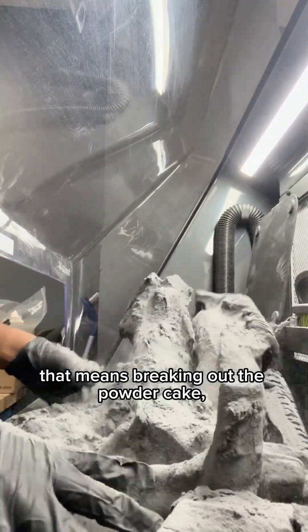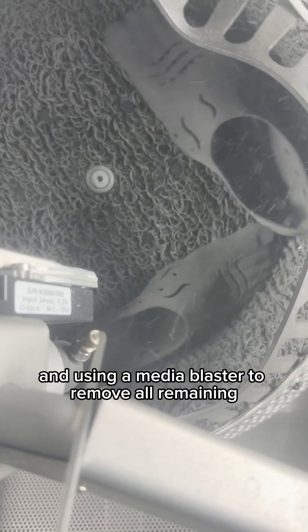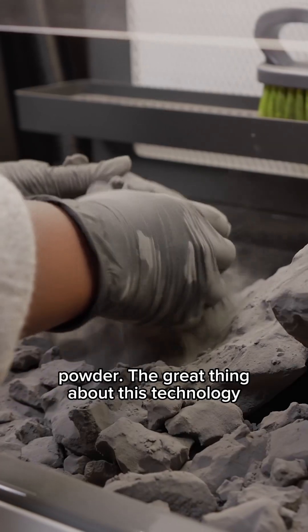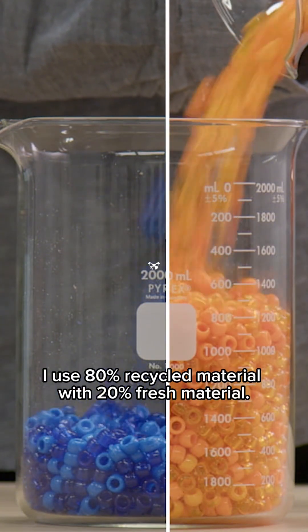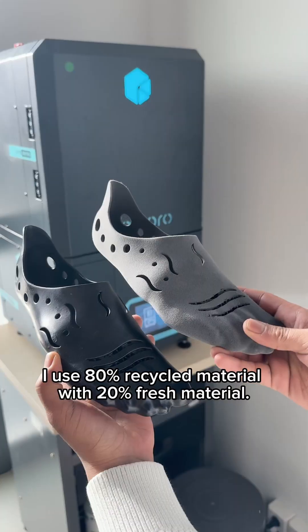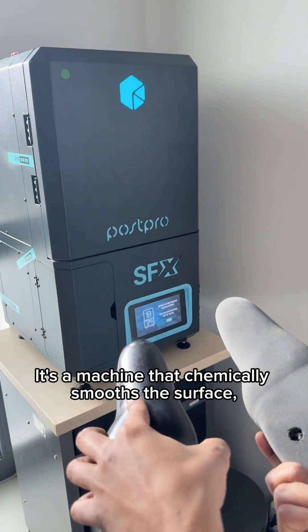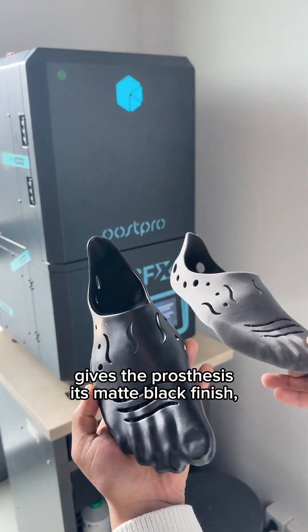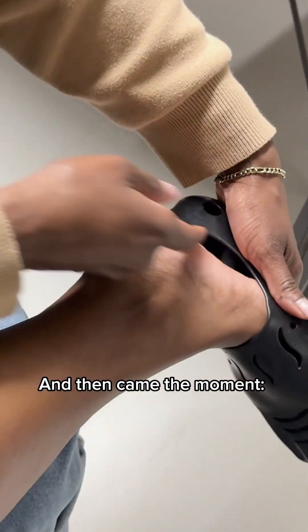After printing, it was time for post-processing. That means breaking out the powder cake, brushing the parts, and using a media blaster to remove all remaining powder. The great thing about this technology is that the material is recyclable — for every new print, I use 80% recycled material with 20% fresh material. Finally, we vapor smoothed it using the AMT PostPro SFX, a machine that chemically smooths the surface, gives the prosthesis its matte black finish, and makes the material more comfortable to wear in most cases.